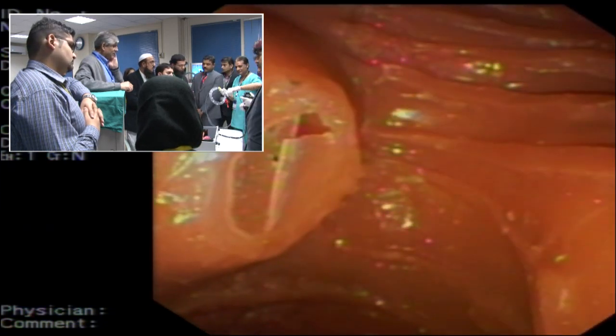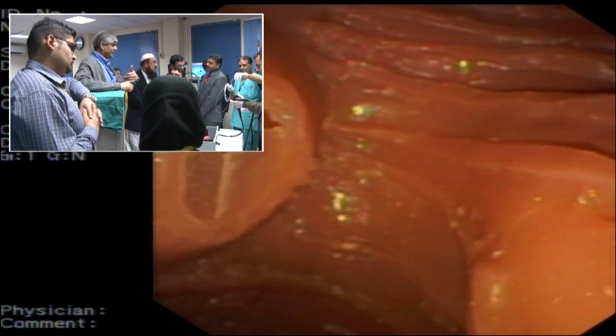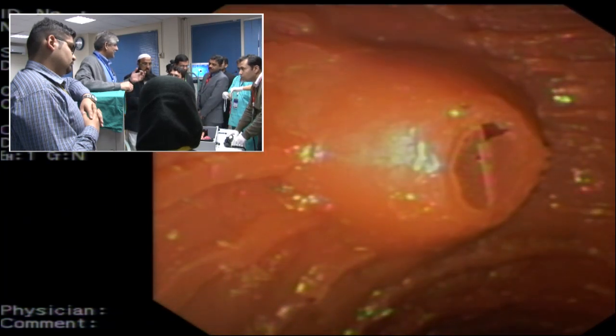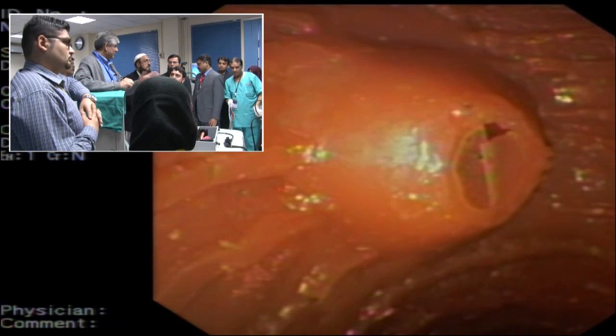I don't want struggling. We'll do some homework on this later, and then we'll try and see if we can use this concept. But you guys, listening to your experience in the units you're coming from, you really don't need so much of getting to the duodenum. That's not a problem here with you people. It's more of positioning of the ampulla, which is what I have to do.